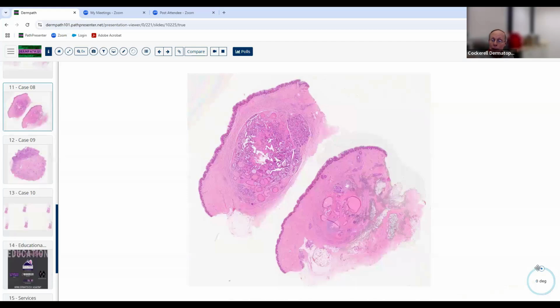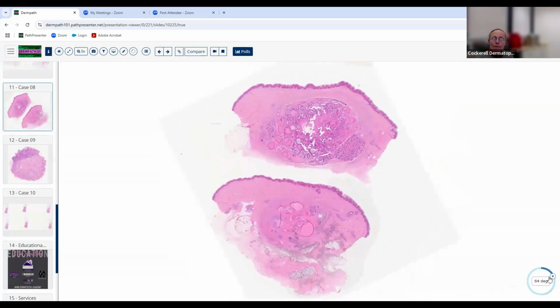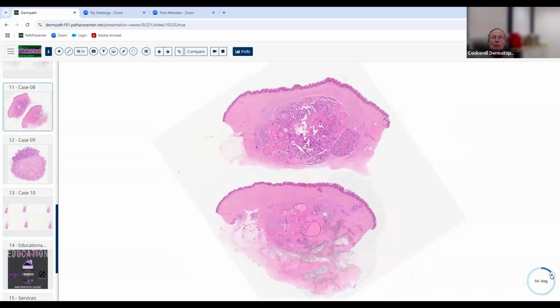I've got another example here of a neoplastic process. Another excisional biopsy. They took the entire thing out. I don't know if they had taken a prior biopsy and couldn't get it out, but they took the whole thing out. It's a gorgeous biopsy. Once again, at low magnification, it's epithelial and non-spindle. It looks pretty symmetrical. It's pretty small and well contained here. We can draw a line around the whole thing.